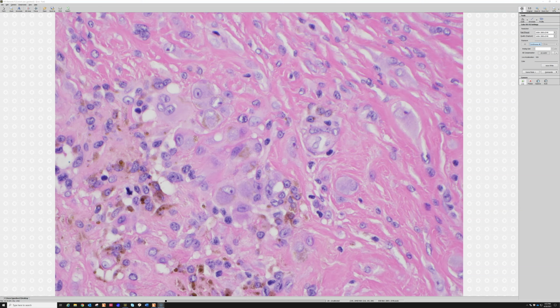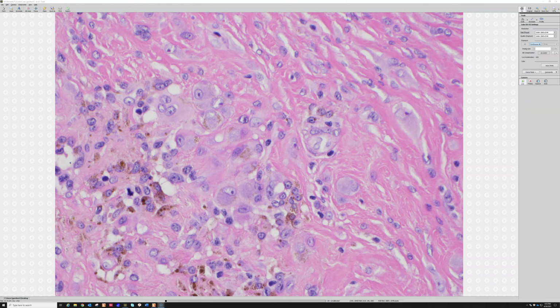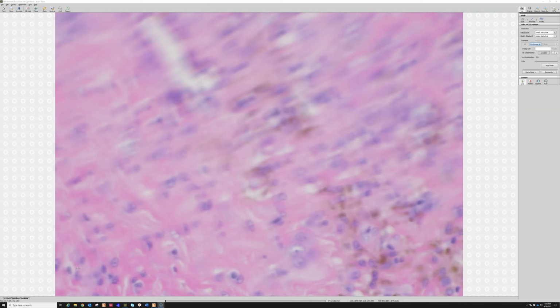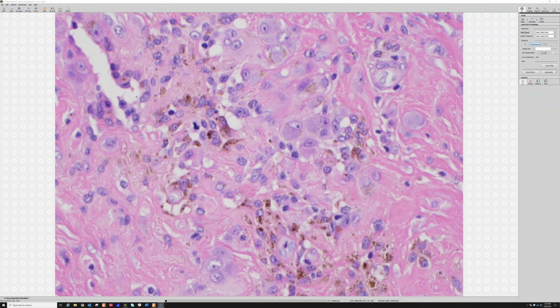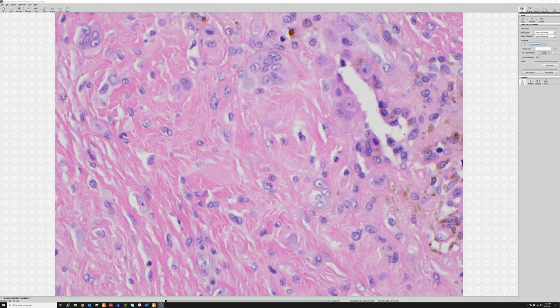And then look, they often have mitoses, sometimes many mitoses, and they can be very scary to see, these large, plump, epithelioid-looking cells and then find mitoses everywhere. So you may notice I'm talking about a tenosynovial giant cell tumor, or a giant, oh, I forgot to mention, the other name for the localized form of tenosynovial giant cell tumor is also giant cell tumor of tendon sheath, which is what this is.